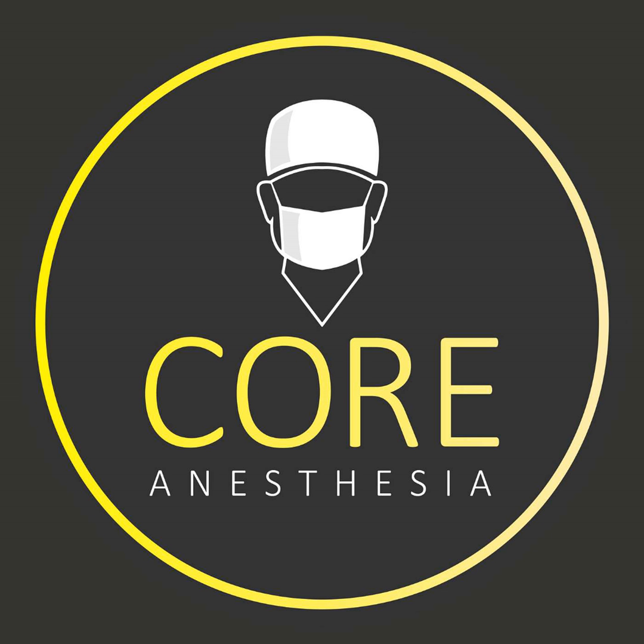The Miller blade also has some advantages. Oftentimes we'll use this for pediatric patients simply because it is a little bit easier with smaller mouth openings, has a smaller profile, and just frankly, you're going to get a better view with a Miller blade than you will with a Mac. And if you use both blades, you'll see the difference.